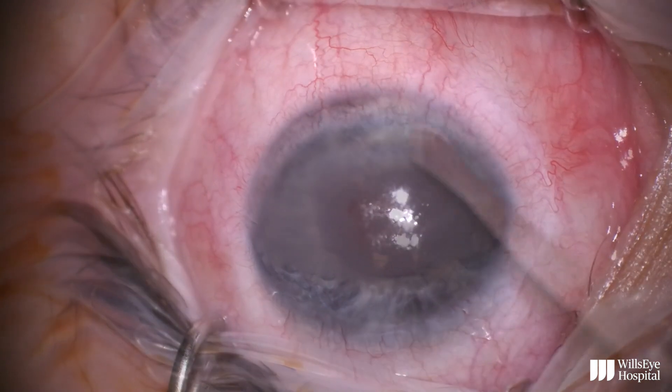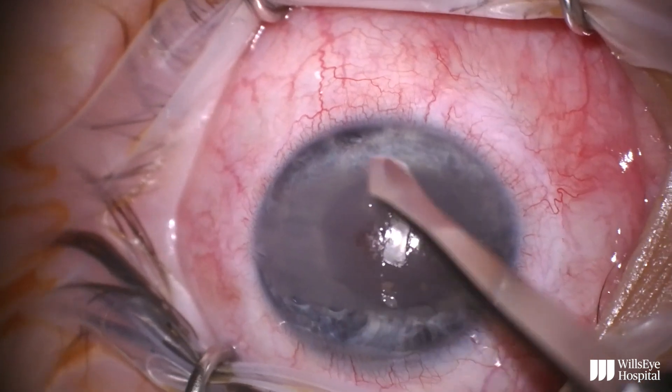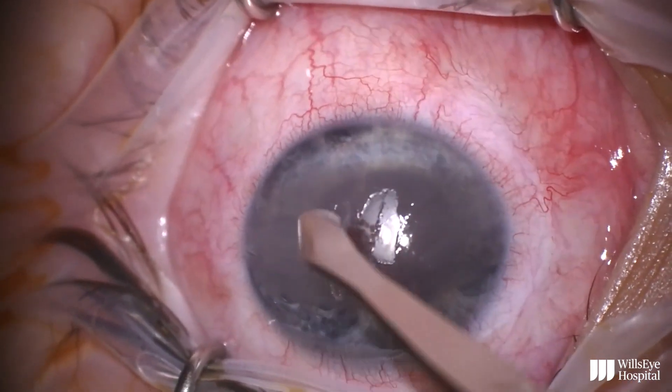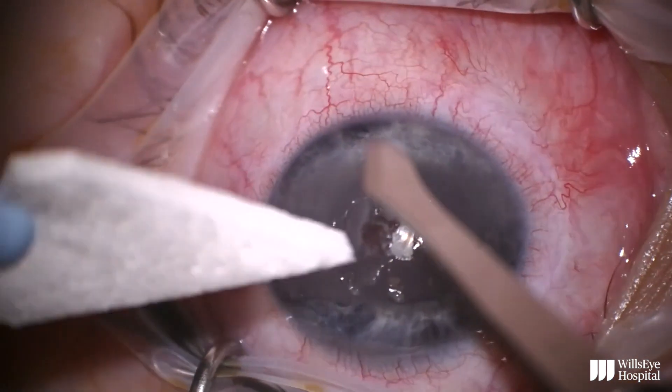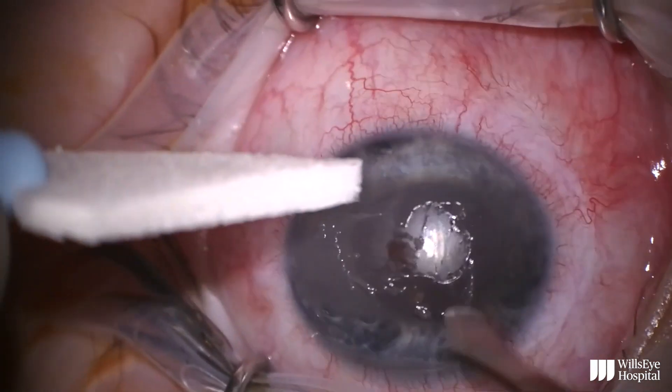The first step of this surgery is to remove the corneal epithelium overlying the areas of calcium deposition. I prefer to use a 57 blade as well as a Wexel sponge for this step, and generally the epithelium is removed quite easily.